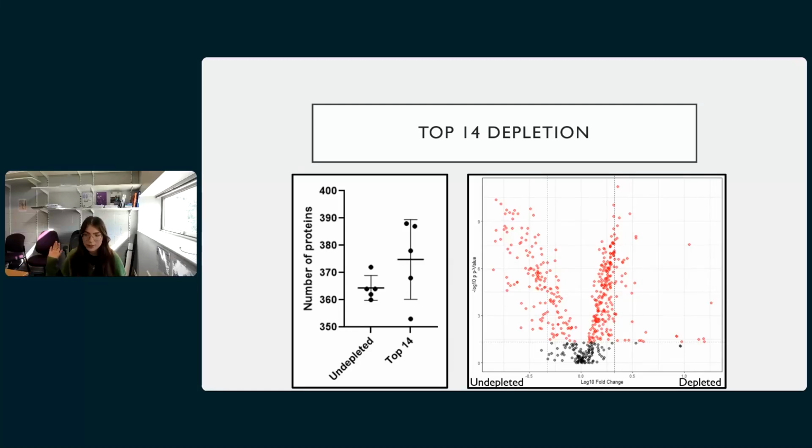Now, although hemoglobin has been the main culprit that we've discussed concerning ion suppression, we're going to push that to the side. 55% of whole blood is made up of plasma, and 99% of the protein concentration of the plasma proteome is made up of 14 specific proteins, and these are globulins, fibrinogens, and albumins. So these still vastly contribute to the proteome of your whole blood, and therefore to ion suppression.